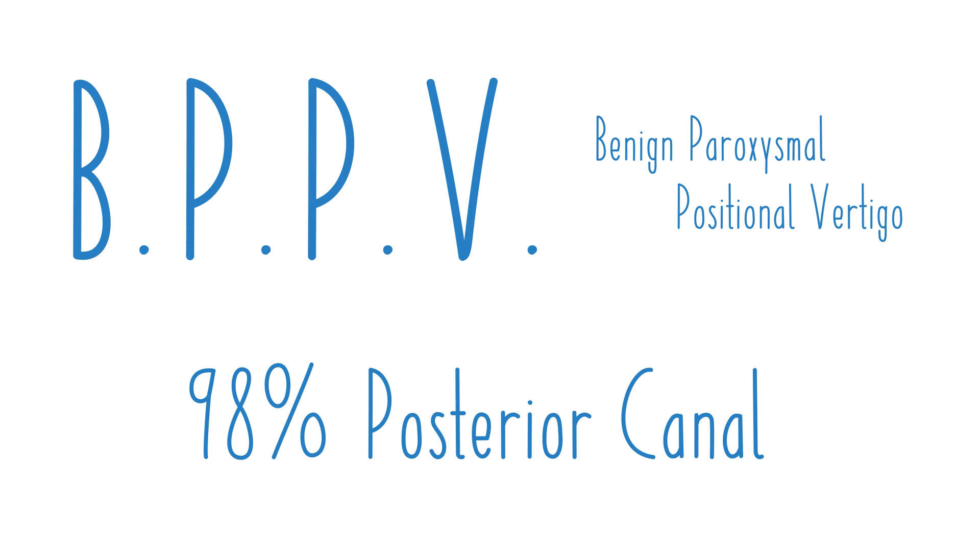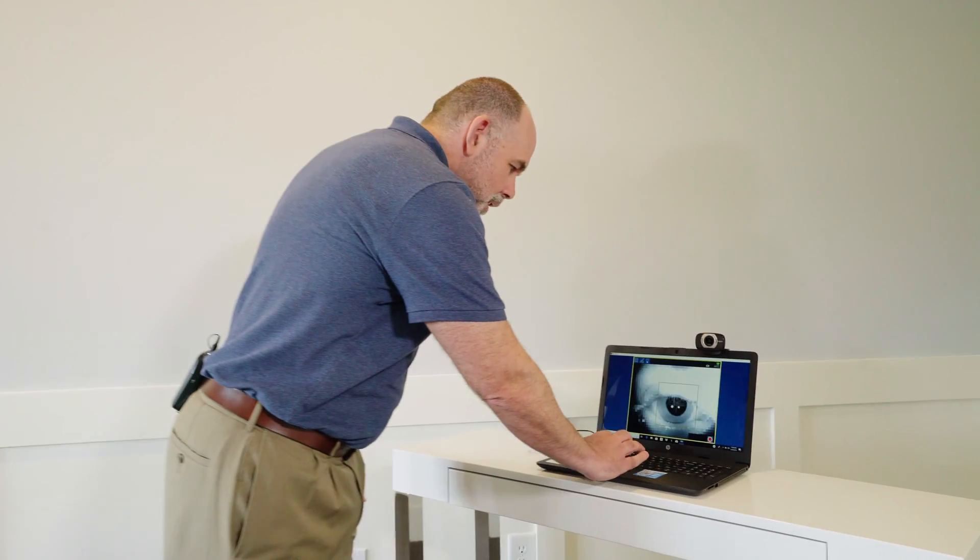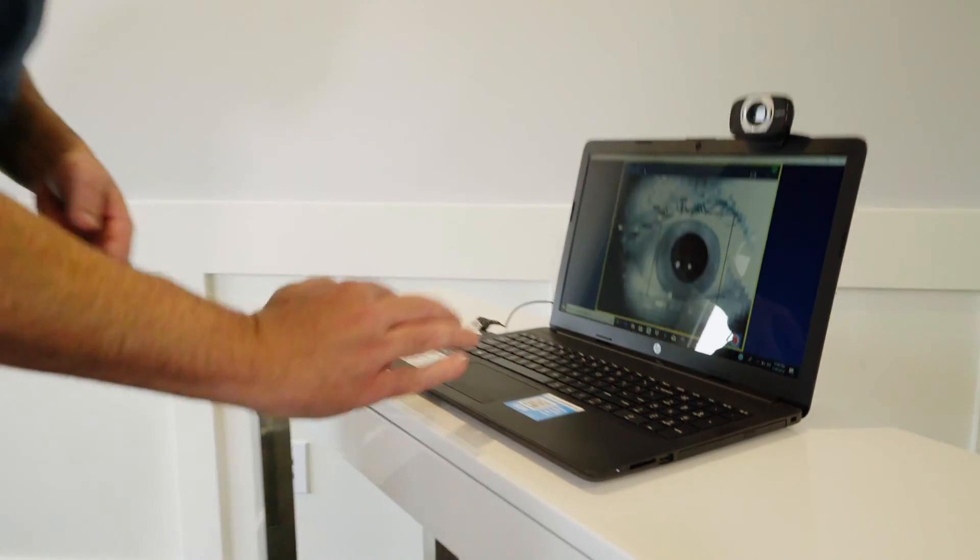Studies have shown that with BPPV, 98% of cases involve the posterior canal of the inner ear. In order to test the posterior canal, we're going to do the Dix-Hallpike test and demonstrate that using the wireless video Frenzel goggles. To do that, I'm first going to come over and we're going to press record.